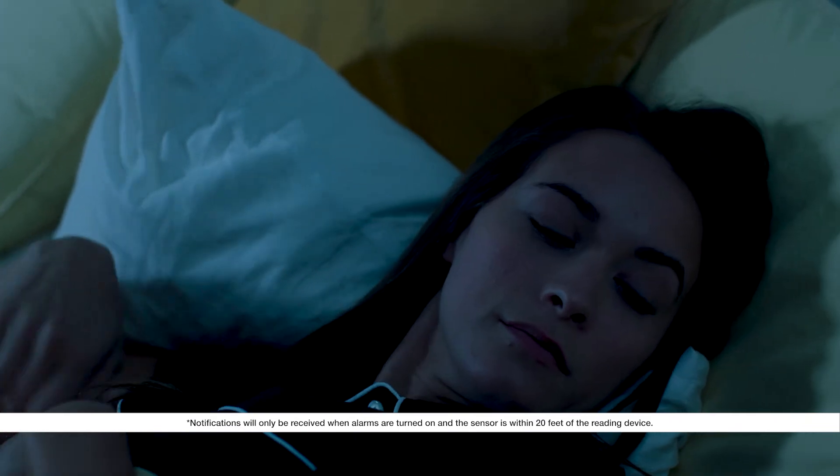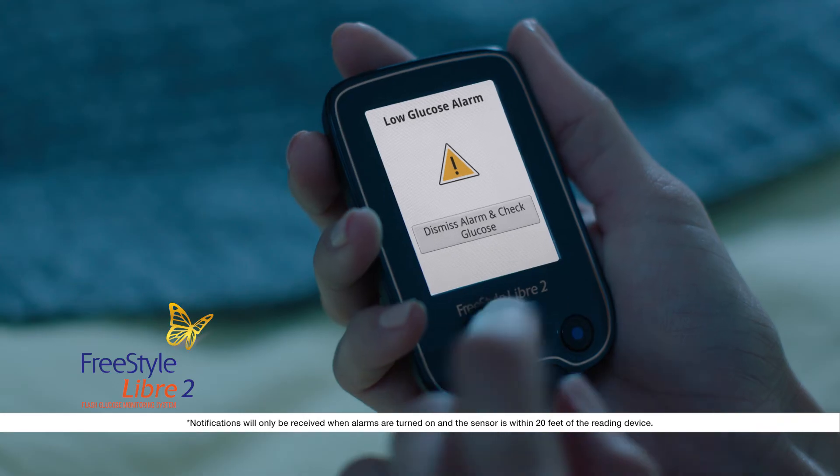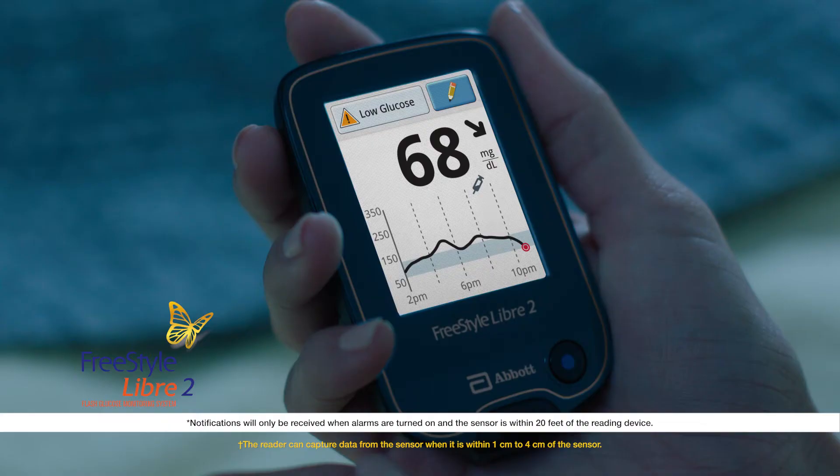If you ignore the alarm, you'll receive it again in five minutes if the condition still exists. Touch dismiss and check glucose to accept the alarm, then scan the sensor with the reader to see your glucose reading and take the appropriate action.